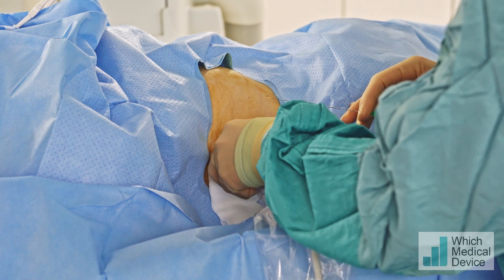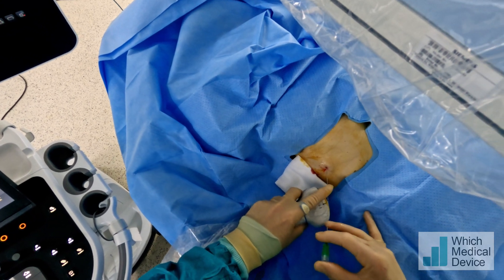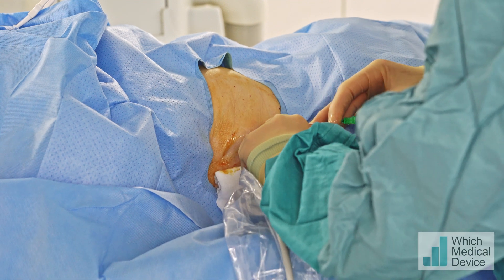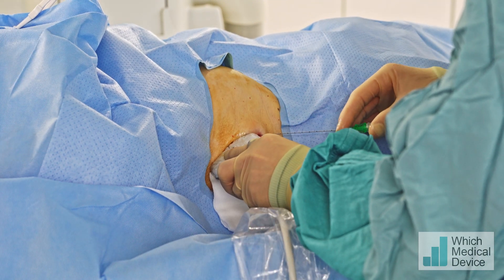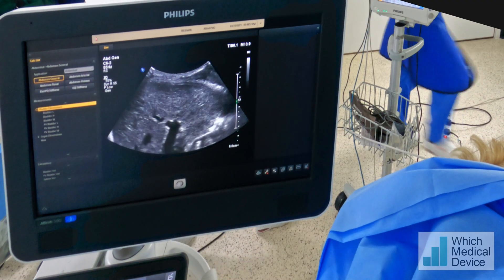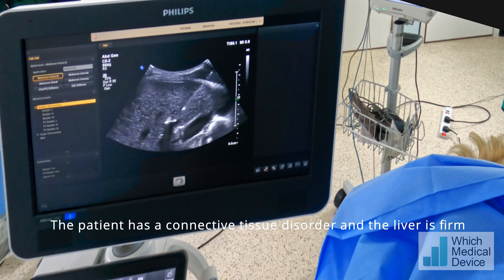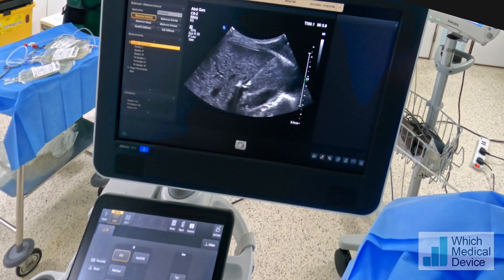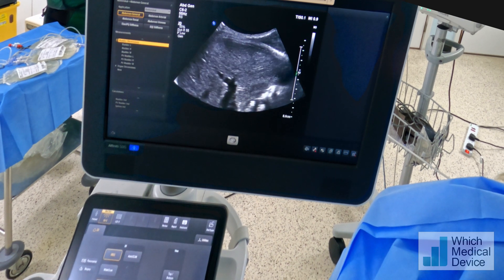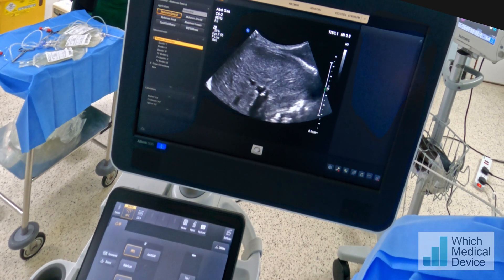I'm just going to look at the portal vein again — happy with that angle. We're going to pop the 21-gauge needle through the skin, so a bit of pushing now. We need to line the two up so we've got a good view, and that should be straight into the portal vein now. There — we've got a good view of it in the portal vein.